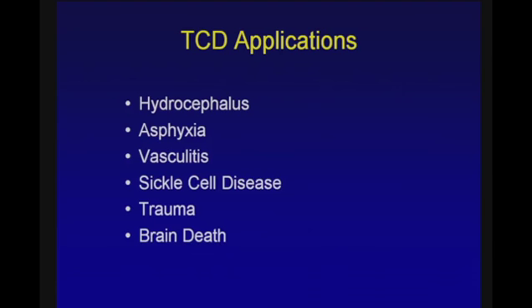So what are the applications of TCD? For the next half an hour, I'll be discussing its use in assessing for hydrocephalus, asphyxia, vasculitis, sickle cell disease, trauma, and brain death.